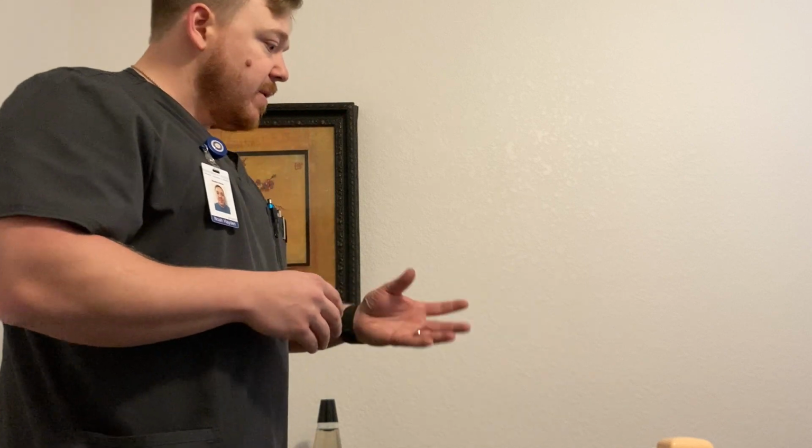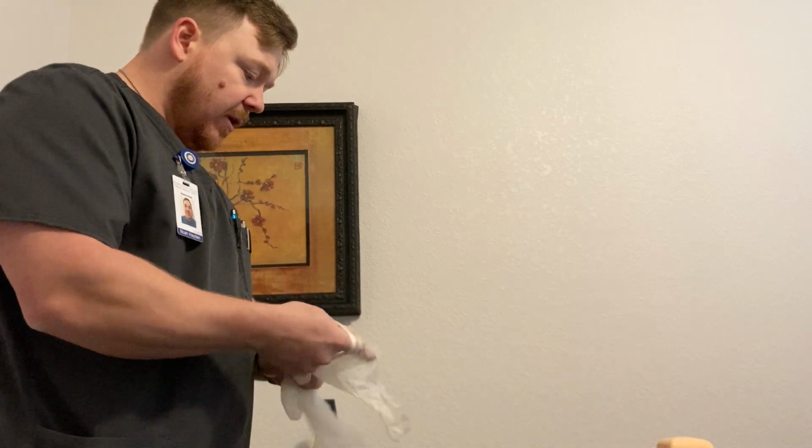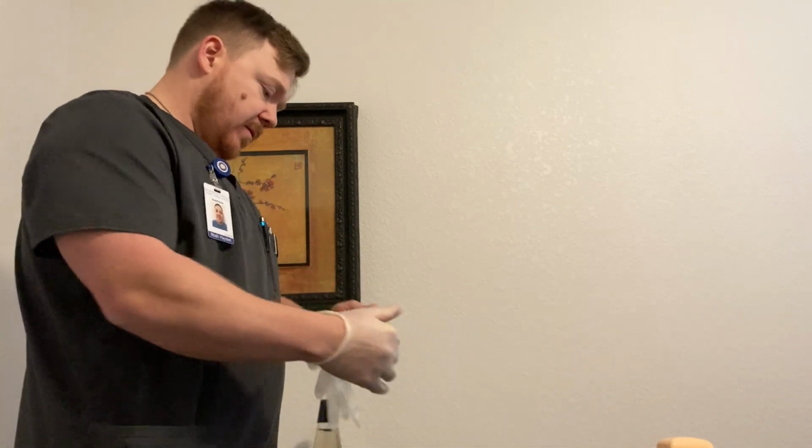Okay, Mr. Smith, I'm going to go ahead and take a look at your abdomen. That's where I'm going to plan on injecting this. So I will perform some hand hygiene. I'll put on a fresh pair of gloves here. All right.